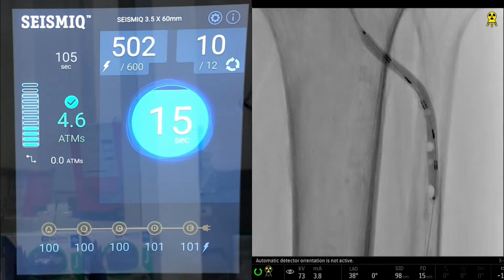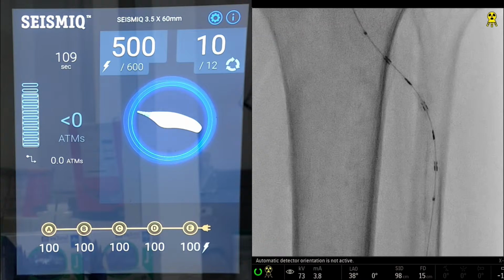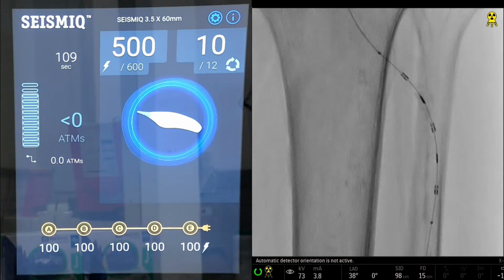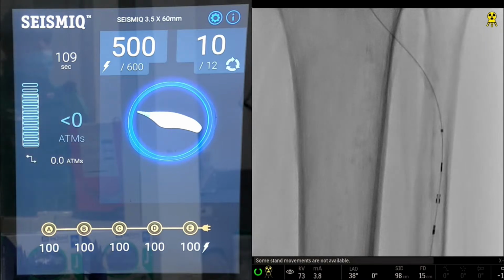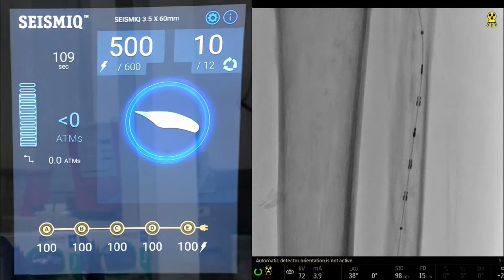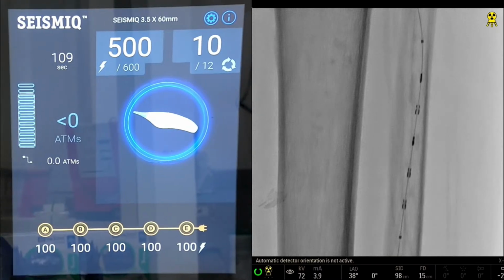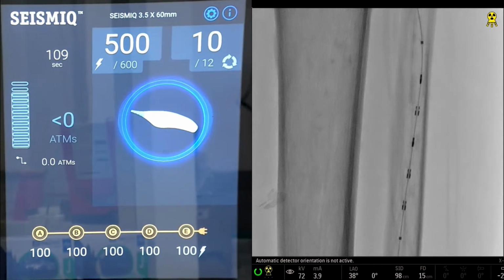And what I think we're going to do is we're going to do one level down in just a second. So let's deflate this. And again, if you can pin, I'm going to pin this down. I'm going to move it down and then refocus it. And again, this is a 3.5 millimeter IVL catheter, but I feel really good about the sizing based on the IVUS measurements that we were able to obtain. And so again, let's try to go up again.